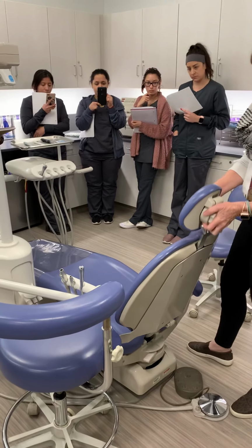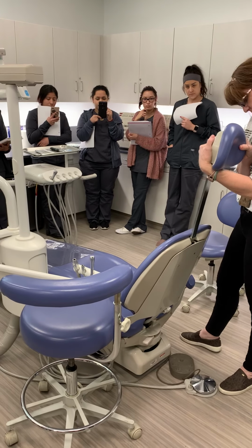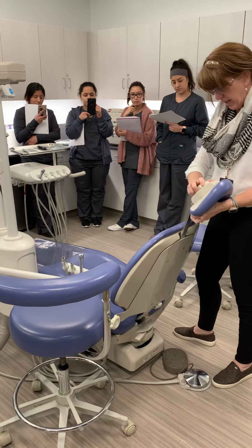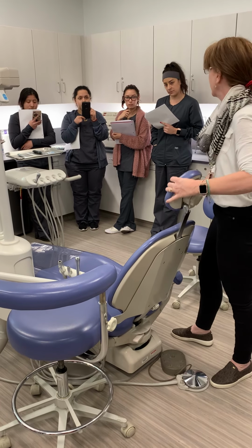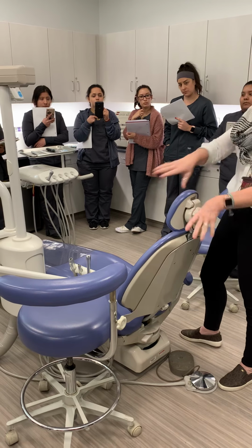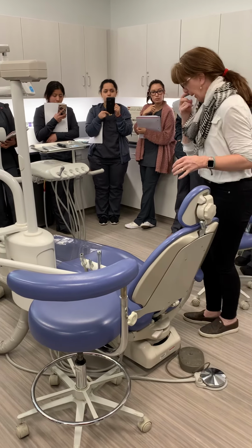You can adjust the headrest by lifting up and down, taking it out if there's someone who is handicapped, like in a wheelchair, or you can adjust it for height and or size of the patient, or you can take it completely off for pedo. You don't really have to say all that verbiage. Just show us that you can adjust it or how it can be put in for someone who's handicapped, okay?